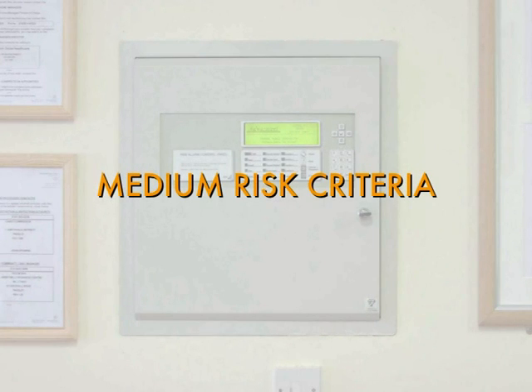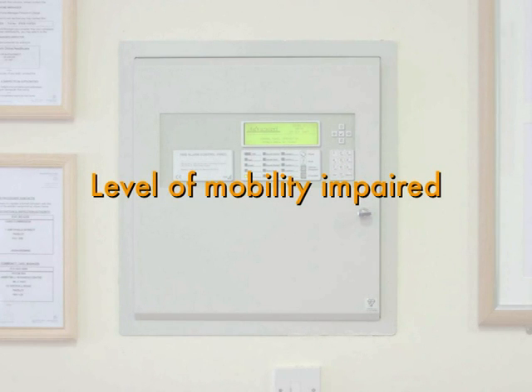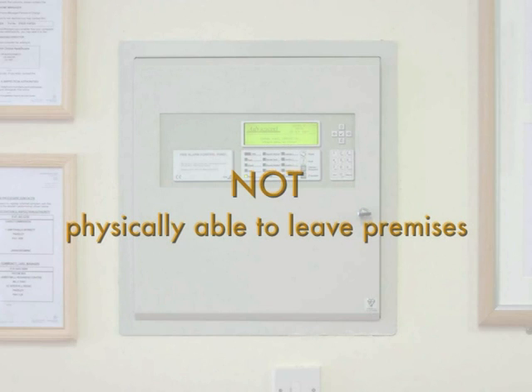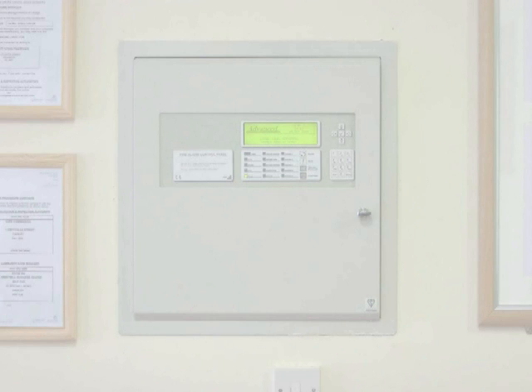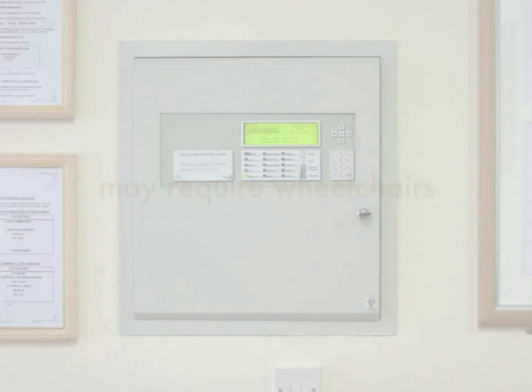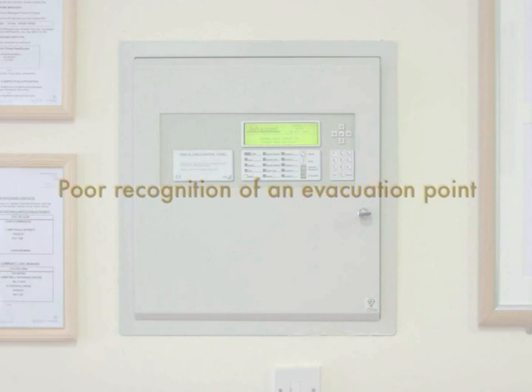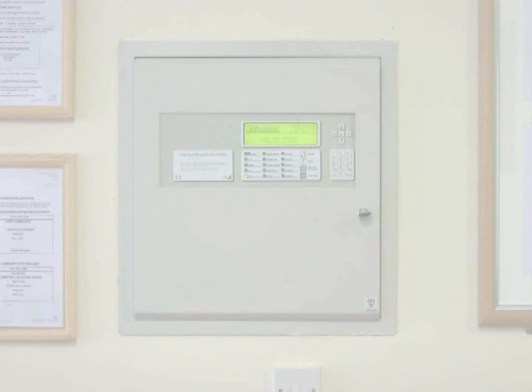In the medium risk criteria, or amber light, the level of mobility is impaired, and regardless of their independent mobility, service users are not physically able to leave the premises without assistance of staff. These are service users who may require wheelchairs or assistance of one or more staff members to assist with mobility. They may have a catheter, a sensory impairment, or other factors which limit independent mobility. Service users in this criteria might have a limited ability to follow a direct instruction or have poor recognition of an evacuation point and cannot evacuate without the assistance of care staff.